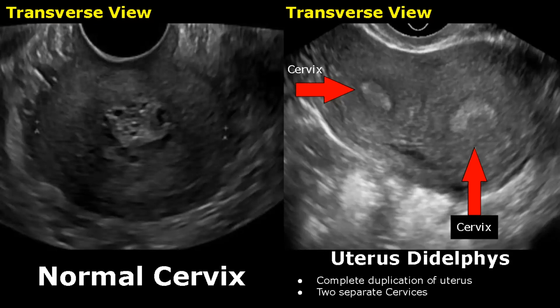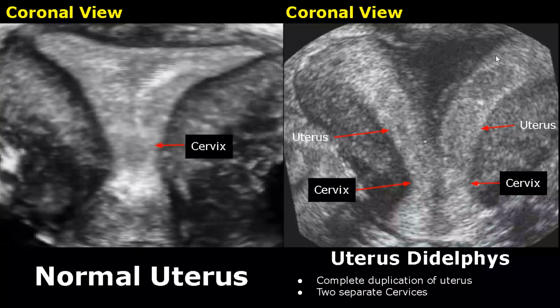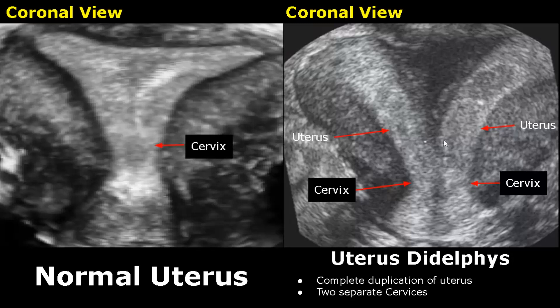These are 3D reconstructed coronal images of the uterus. This view is best for diagnosing congenital uterine malformations. This is how a normal uterus looks in a coronal 3D ultrasound image. And here we have two separate uteri — there is complete duplication of the uterus and cervix.